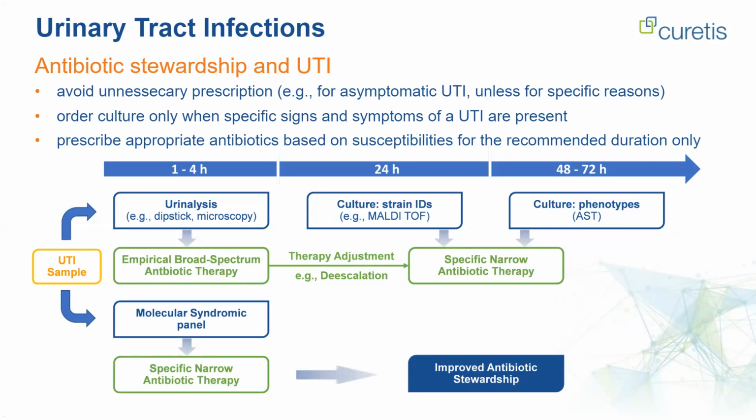I think another important limitation are the antibiotic resistances. So there are many resistances which are conferred by the presence of one specific resistance marker gene, and you can screen for the presence or the absence of such a gene. But there are also other resistant phenotypes which have a more complex origin.